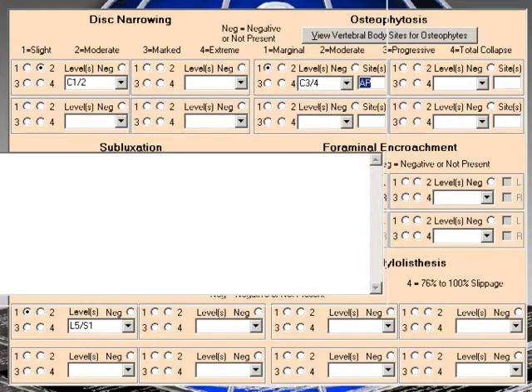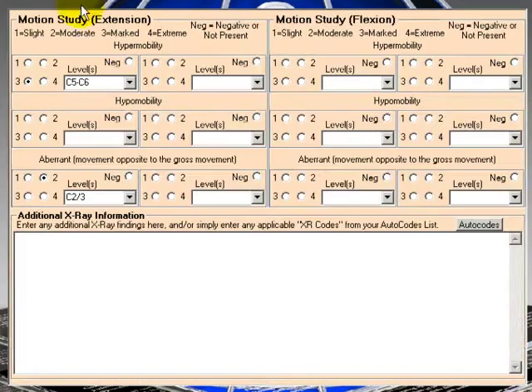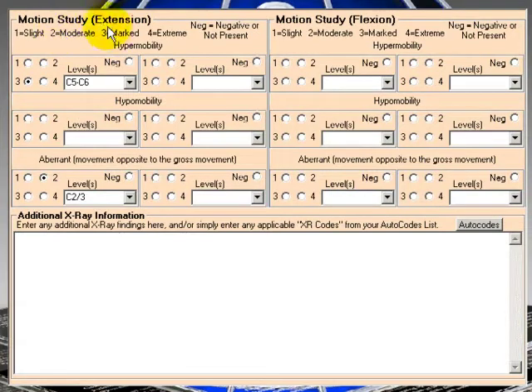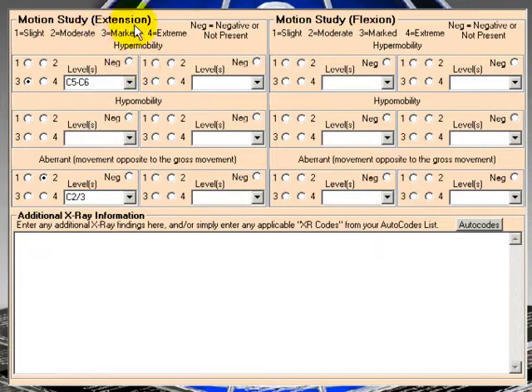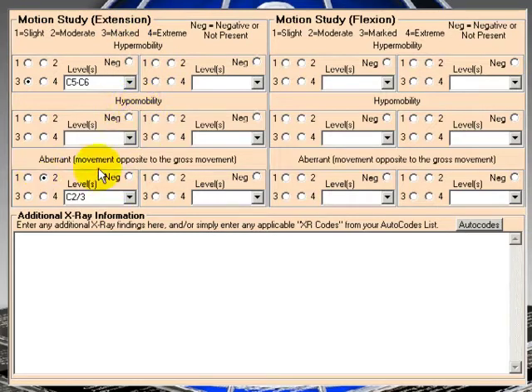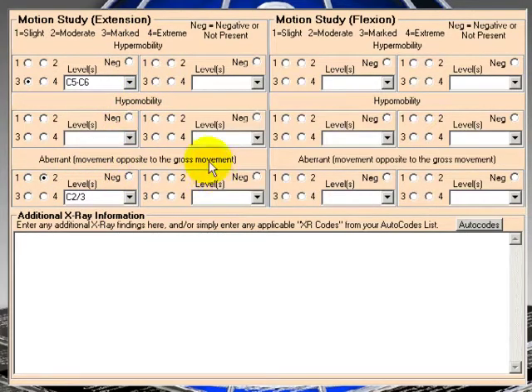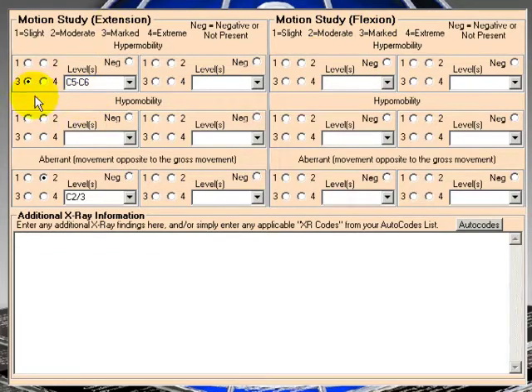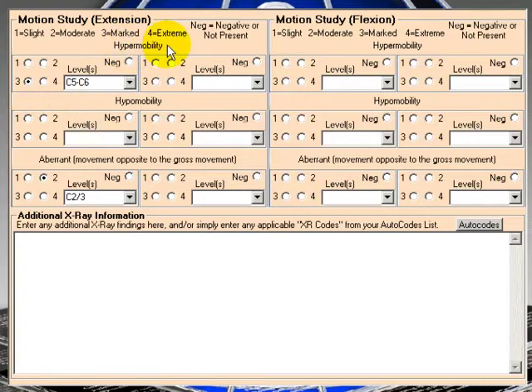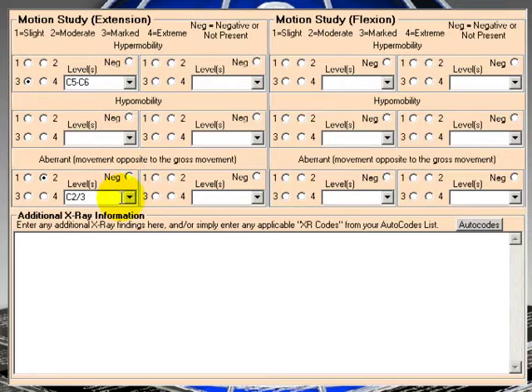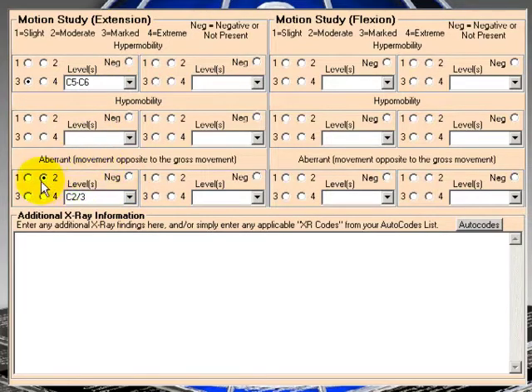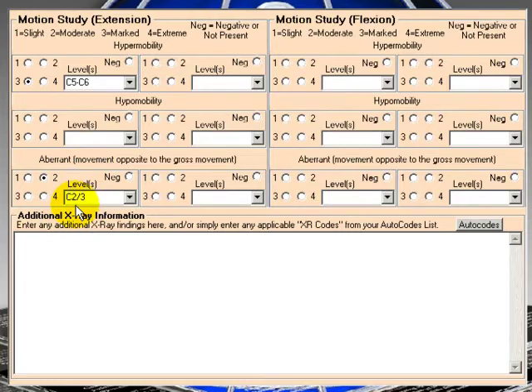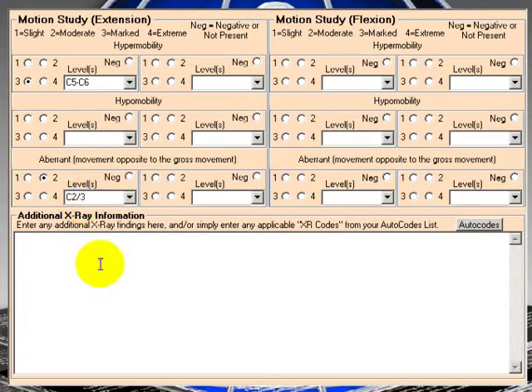Now, if I go to the next screen, here we have motion study extension and flexion. So here for extension, we have hypermobility, hypomobility, or aberrant movement, which is movement opposite to the gross movement. Same things for flexion. And the only data we put in here is we have marked hypermobility upon extension at C5 to 6. And here for aberrant movement, we have moderate aberrant movement at C2 to 3.